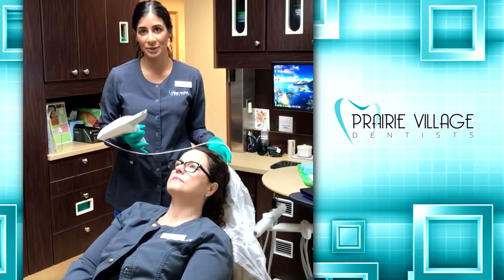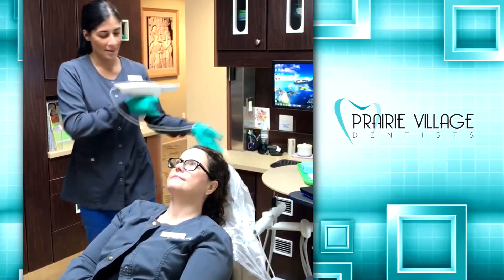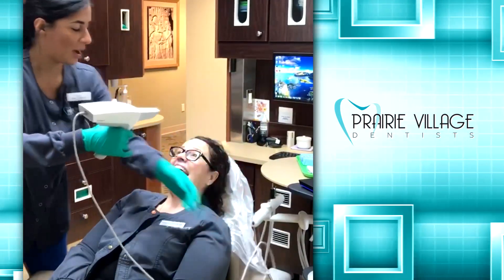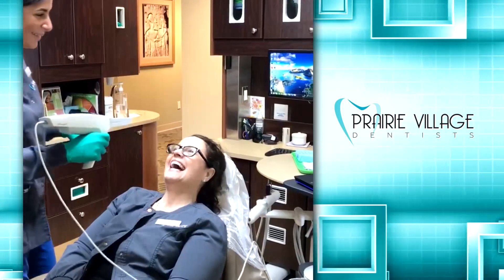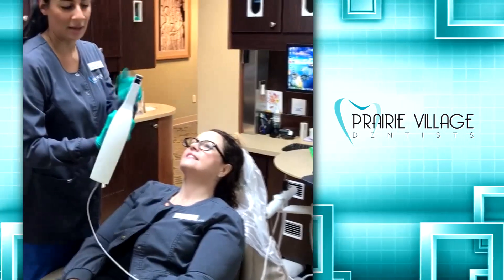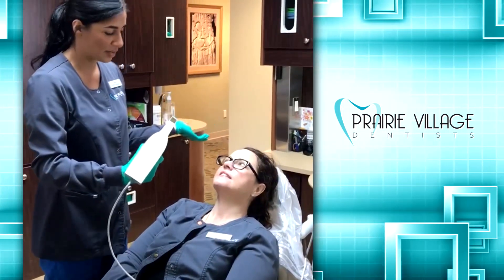I'm just going to give you all a quick demonstration of how it works. This is my lovely model Maria. There's a tiny little camera inside here — you're just going to hear a bunch of little clicking sounds; that's just the camera taking pictures.